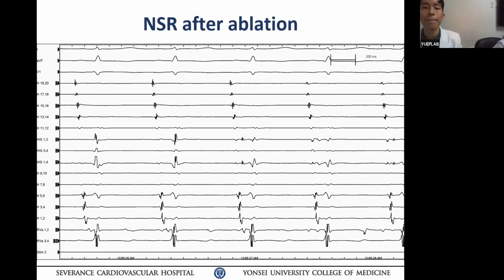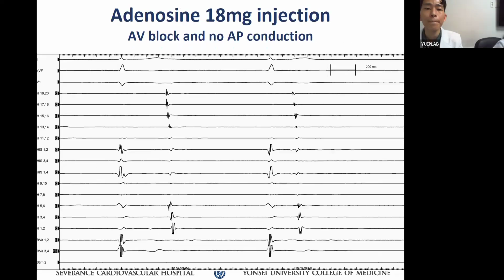Now, I have this question. You guys always give adenosine. If you have a nodoventricular or nodofascicular pathway, what's the role of adenosine after ablation? Did it help you? Doesn't. Both are adenosine sensitive, so why are you wasting your time? But this patient has a bundle. No, I'm asking that question. I mean, routinely using adenosine is not... He did, so. Are you blaming him? Yeah, you're the boss. I asked him not to do that anymore. Are you still giving adenosine routinely? No. I'm just saying, it's very common practice that people give adenosine after pathway ablation.